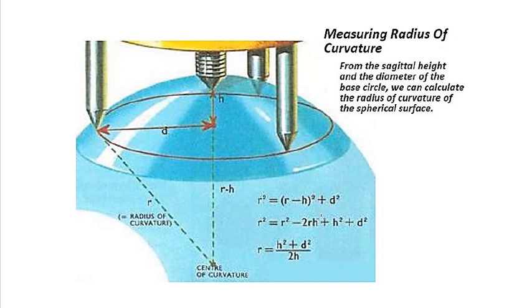These little things students get confused about, of course. We don't use r here, so you don't want to confuse it with the radius of the bigger sphere, because you're dealing with two different circles. One is a sphere and the other is a base circle, connecting the three tips of the three legs. So be careful.